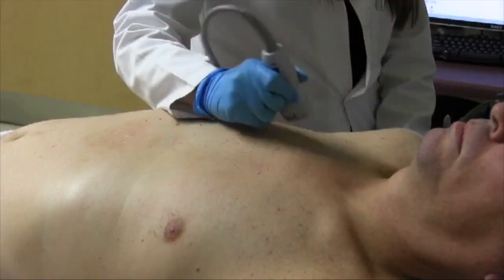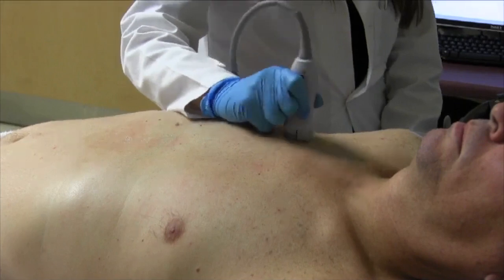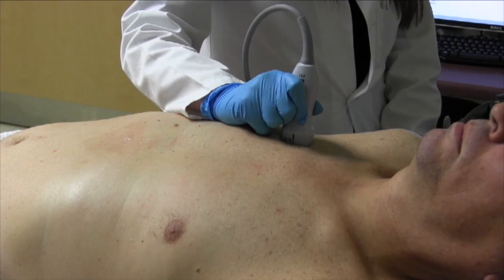Place the patient in a supine or semi-recumbent position and expose the anterior chest. The probe should be held with the probe marker facing cephalad. With its probe marker facing cephalad, the transducer is placed at a 90-degree angle to the patient in the third and fourth intercostal space of the right anterior chest wall at the midclavicular and anterior axillary lines.